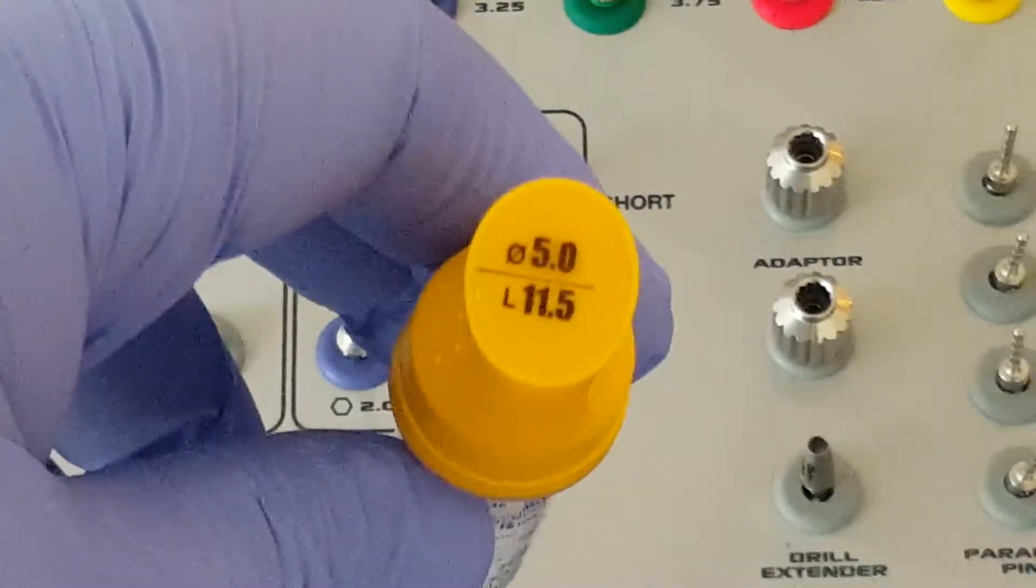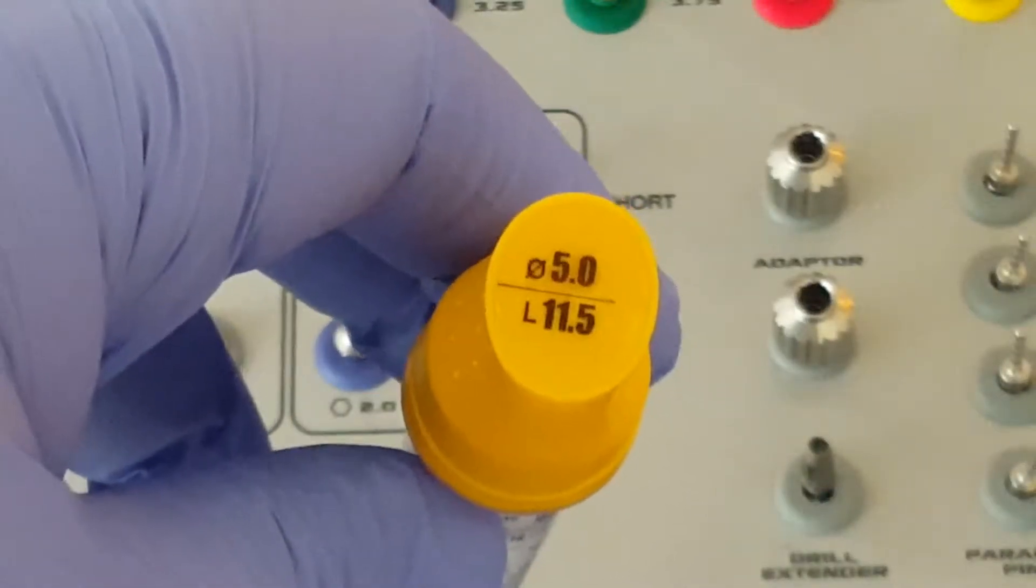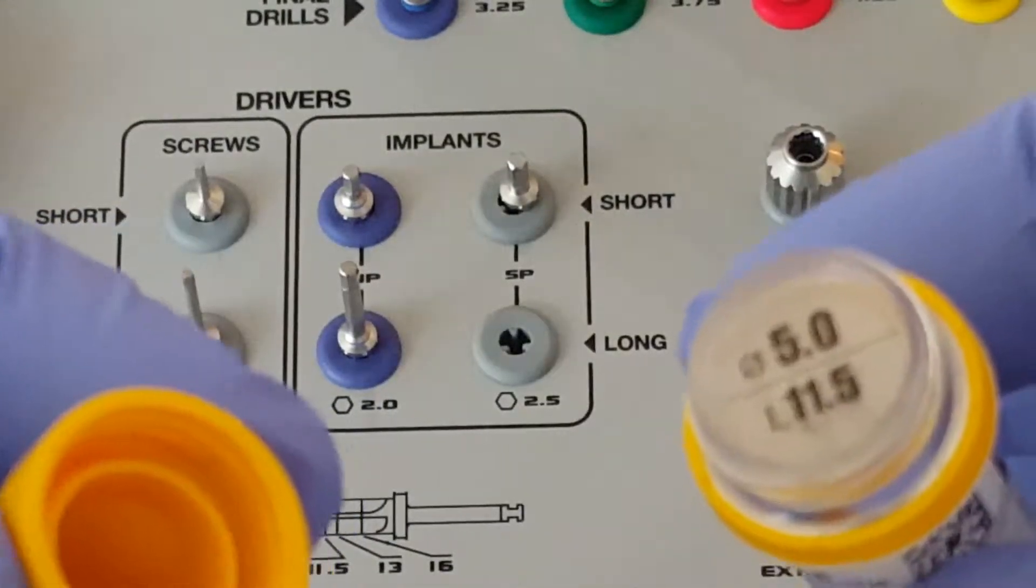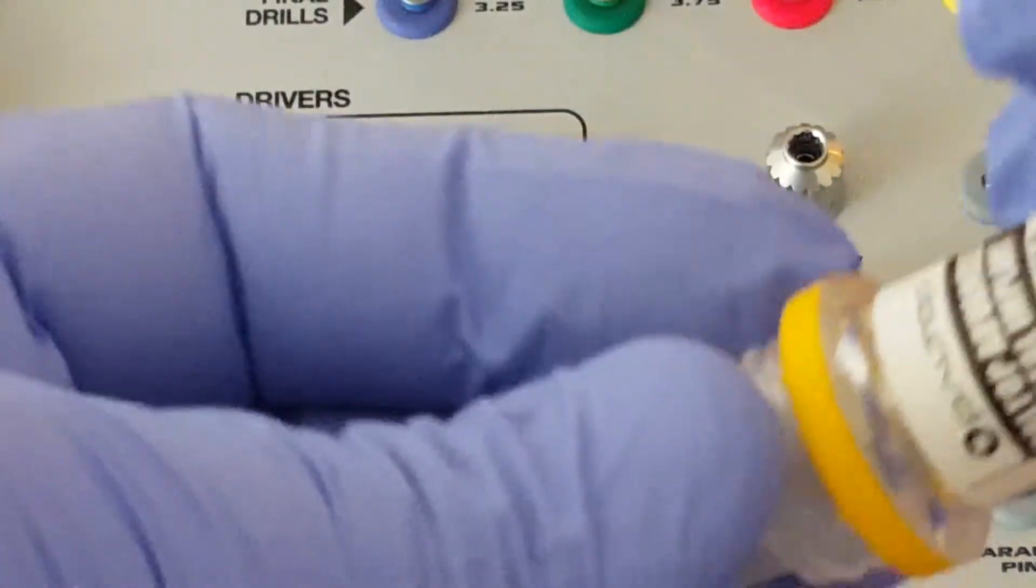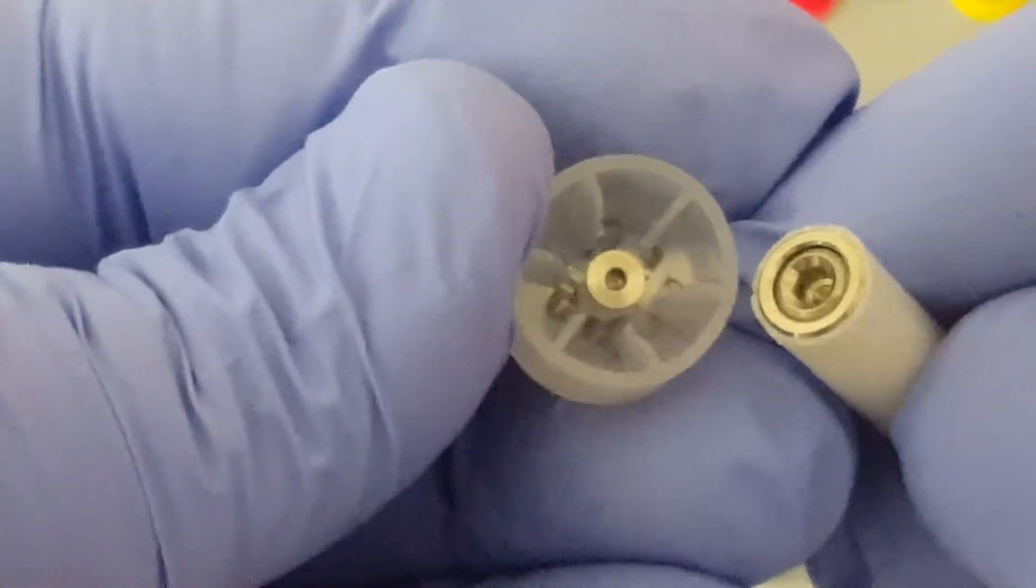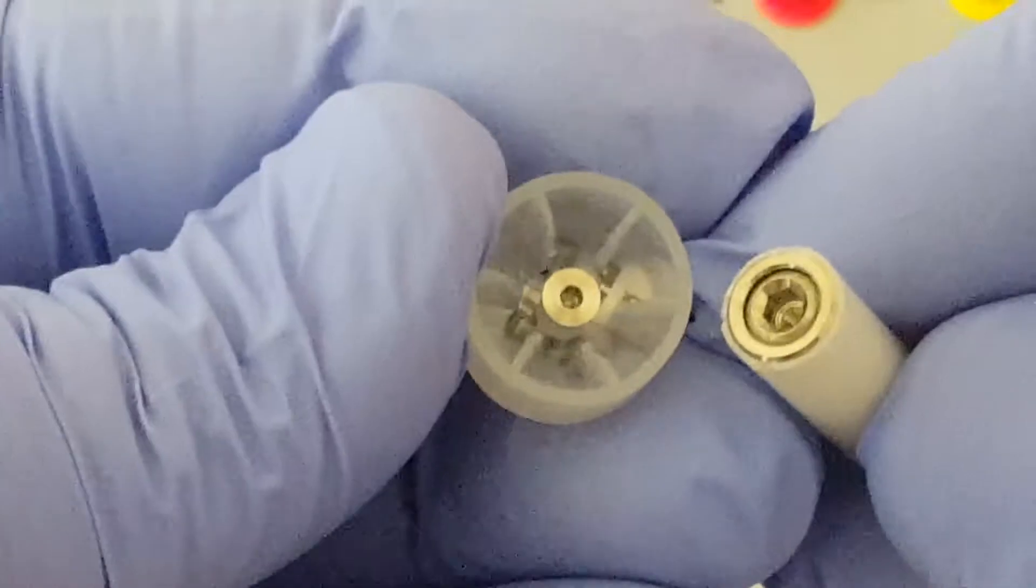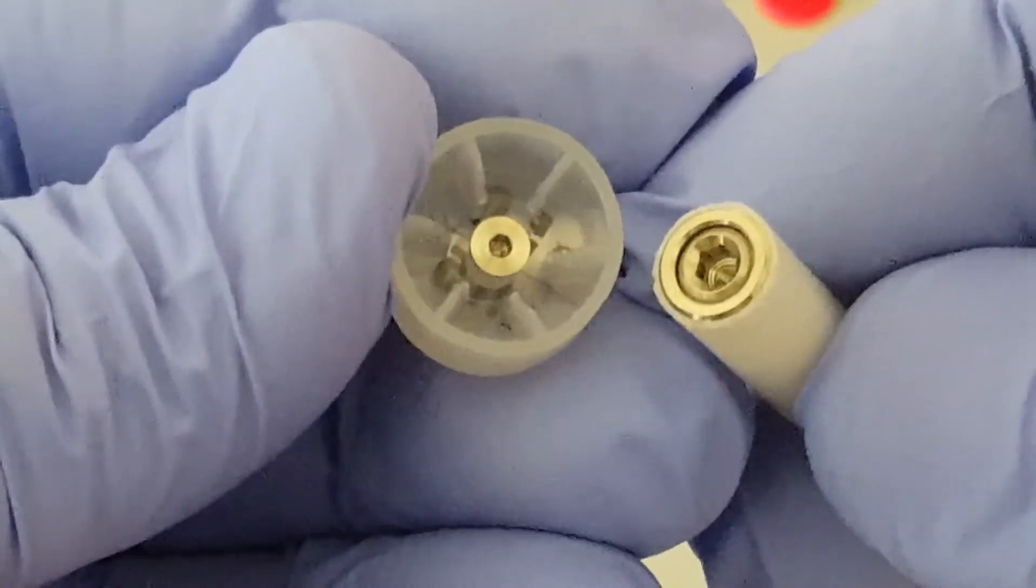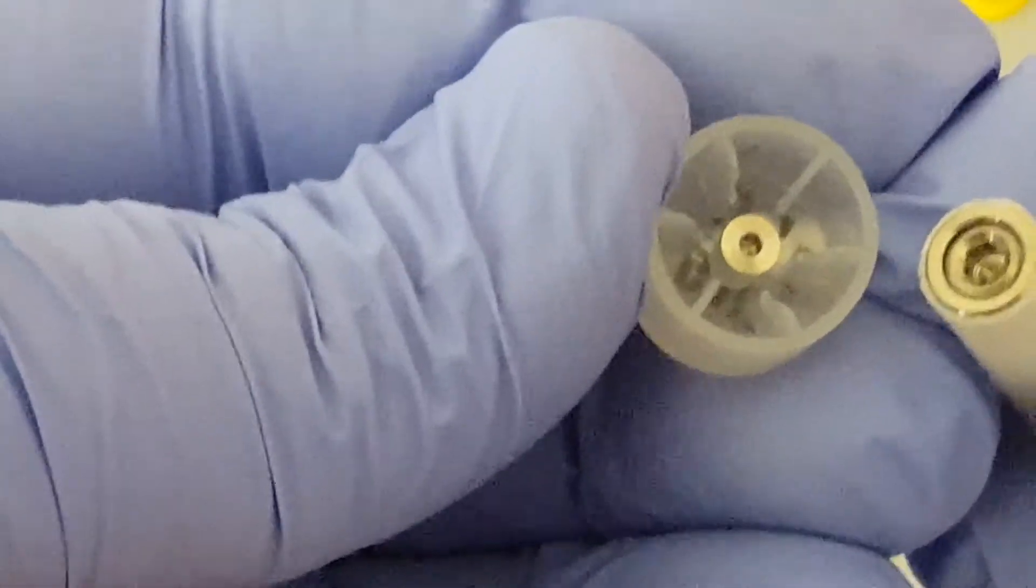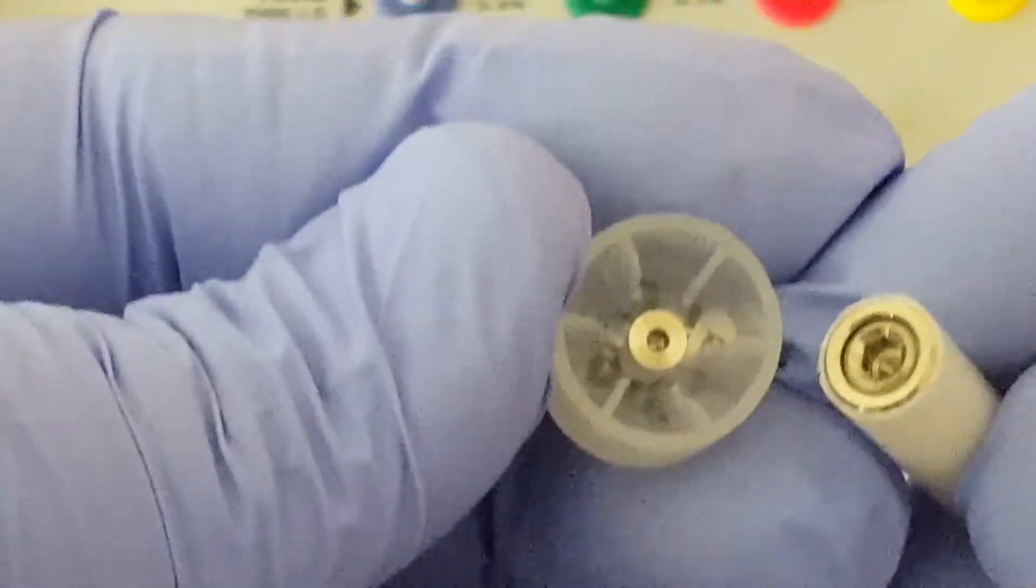The five millimeter implant comes with a yellow top because five millimeter corresponds to yellow. If we open the vial, we can see that we have the inner vial. If we remove that vial and remove the cover, we can see that inside the cover is the cover screw. The 3.25, 3.75, and 4.2 millimeter implants also have the cover screw inside the cover.